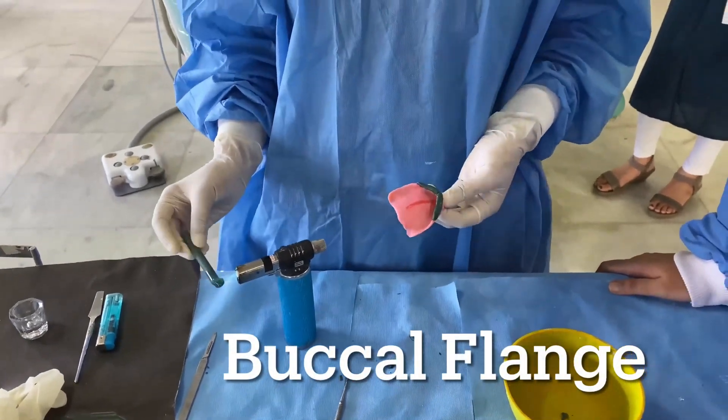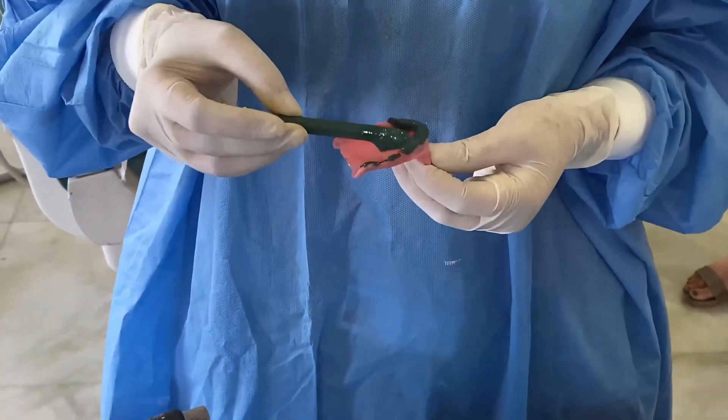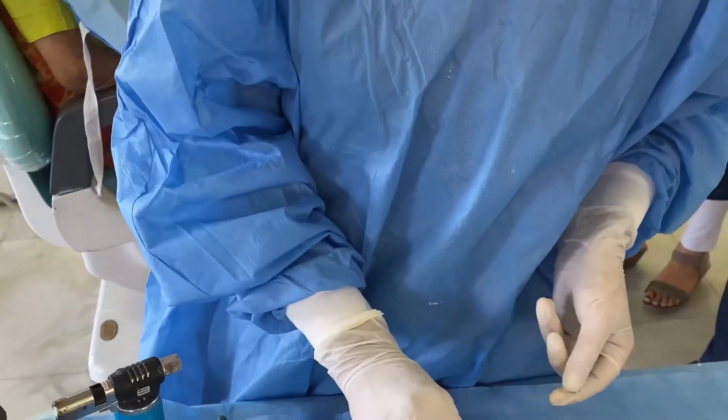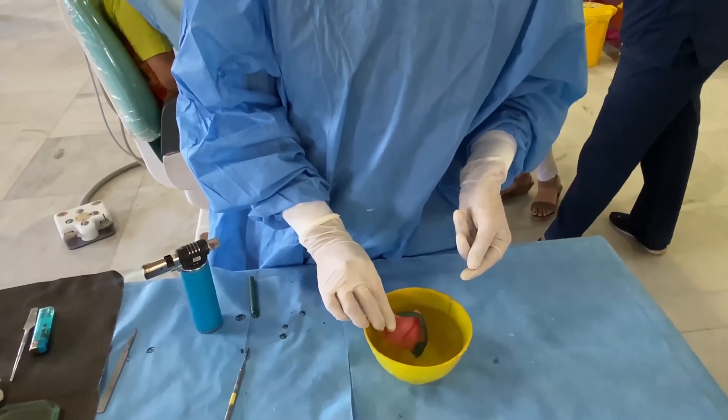The green stick compound should be added on the buckle borders of the tray. Place it in hot water and wet your gloved finger if you are trying to mould the borders. Before inserting it into the patient's mouth, place it in cold water for a few seconds so that the patient will not get any thermal injuries.